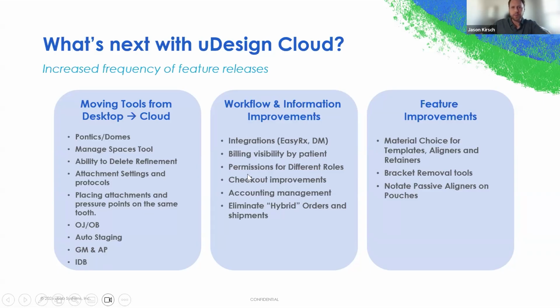Some of the workflow improvements: integration with EasyRx is something that we're actively looking at. We've had a couple of meetings with them already, and we're in the process of making that work because I know a lot of offices are using EasyRx just for patient management. So hopefully soon you'll be able to upload your cases and send your scans directly from EasyRx into the cloud. We're going to make your billing visibility a lot easier.